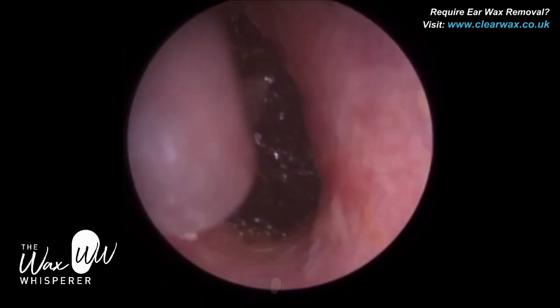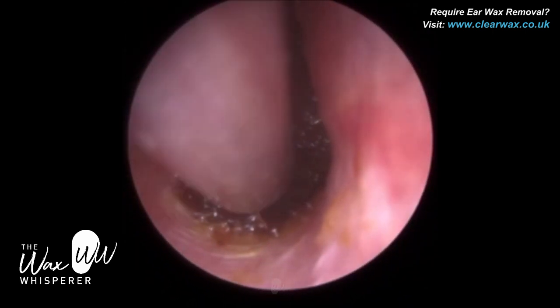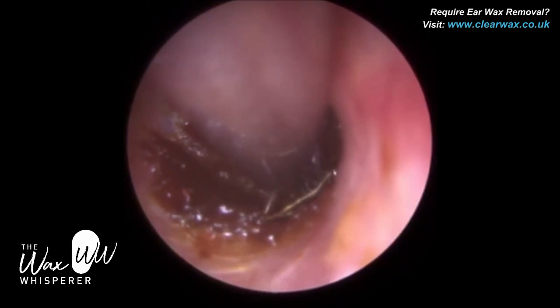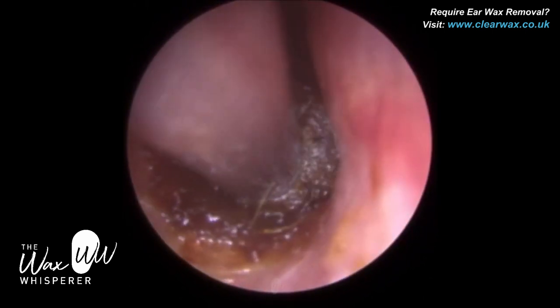You can see the patient's also bruised — just over here on the right-hand side, the ear canal is slightly red. The Q-tip had grazed and rubbed against the anterior canal wall.